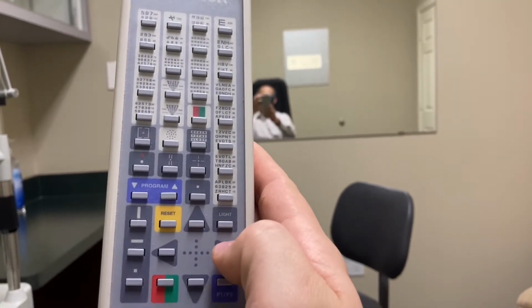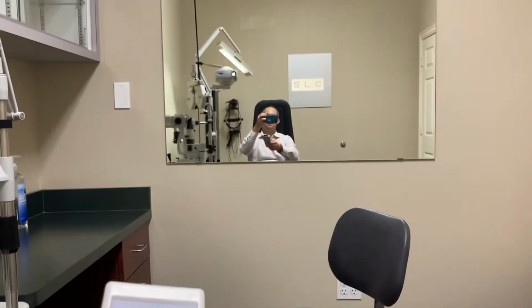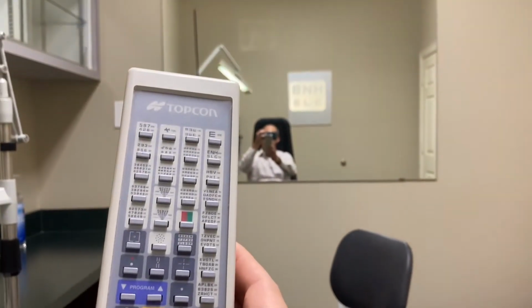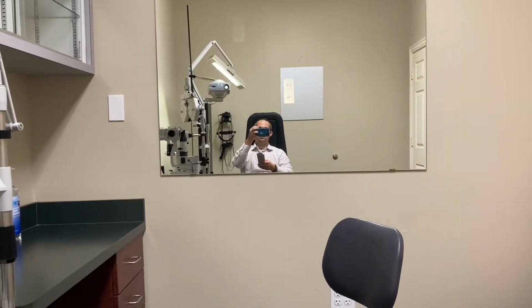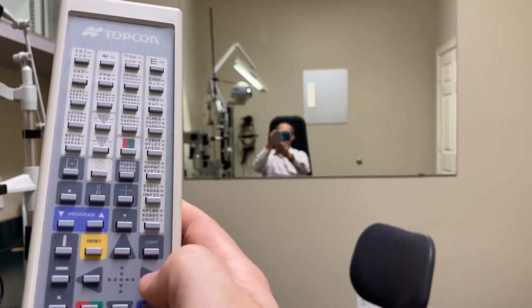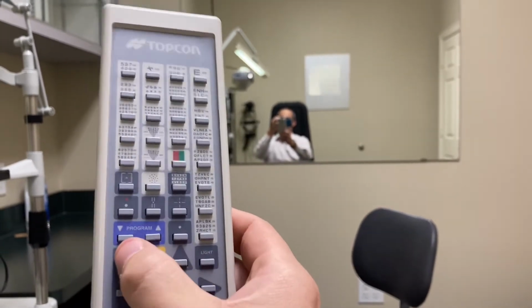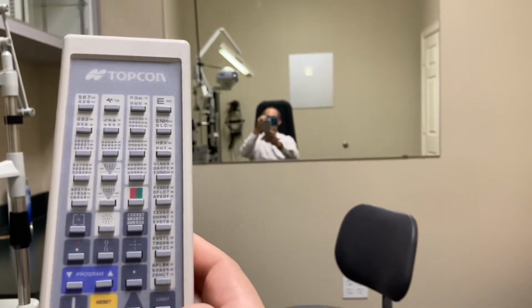If I push a button that doesn't make sense, it'll just beep once and say, now you can't go sideways, that doesn't work. So we're going to push the same button just to go back open, and it undoes it. Isolated line and open. I could do a vertical and ask them how small on those three letters can they read? And I'm just going up and down the chart, pushing up and down like that. And I can also go sideways and do the next row or next column. And I can open it back up. And then on the kids, I can do individual letters and just zip around.